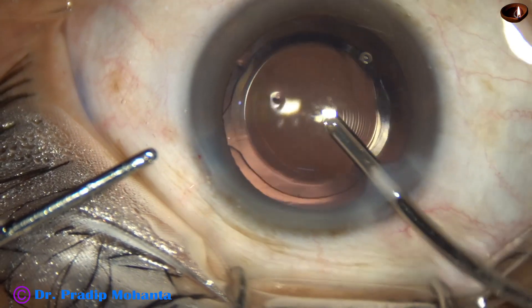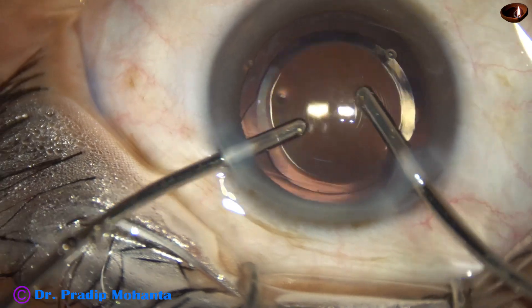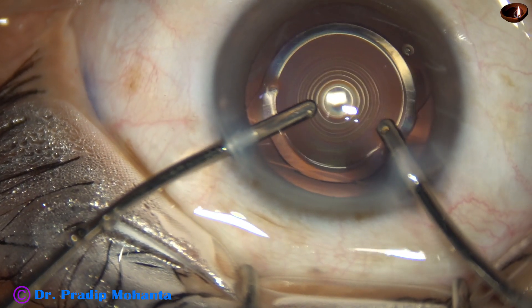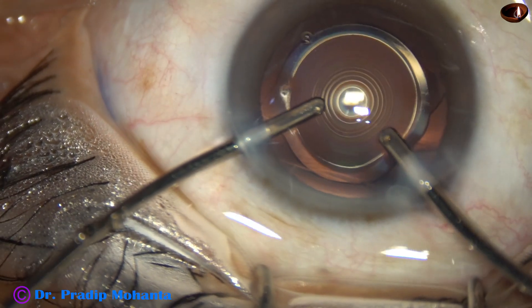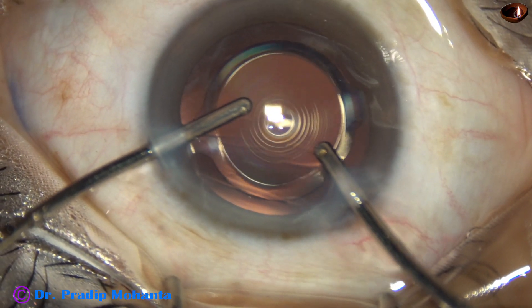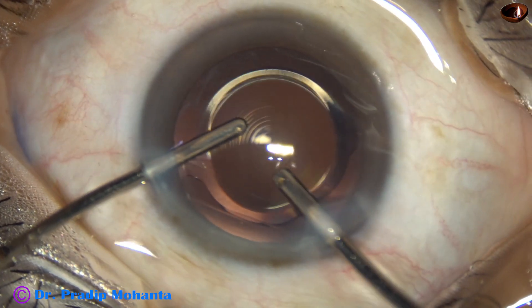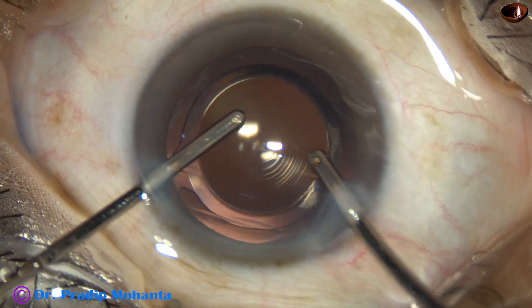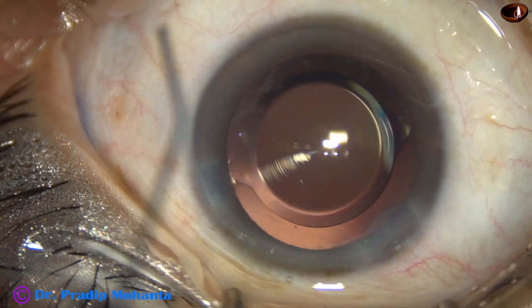Since there is only one side port and if we want to use the main wound for irrigation with less leakage during aspiration, the idea is to just lift the anterior leaf of the main wound a little bit and the leakage will be minimal. You can increase the bottle height to minimize anterior chamber fluctuations. The anterior chamber is nicely maintained and deep, and both probes are at iris plane, far away from the corneal endothelium. Very nice cleaning of visco is done.